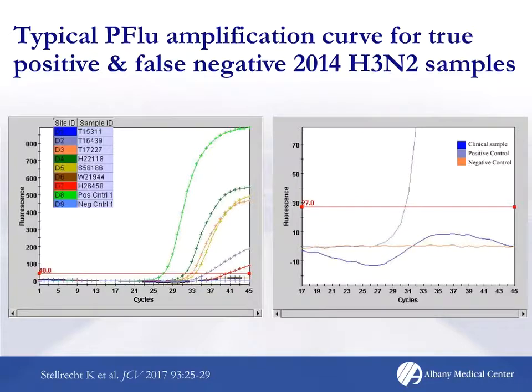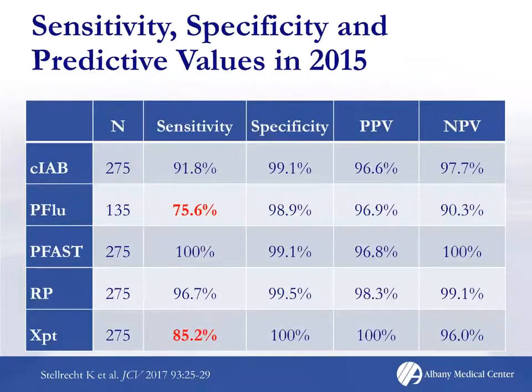So initially, we weren't going to include ProFlu in our study because we knew something strange was going on, and we didn't want to muddy the waters of analyzing the cobas assay. And also at this time, all of a sudden the reports were coming out from the CDC about different viruses that are emerging, that are causing vaccine failure, and so we weren't sure what was going on.